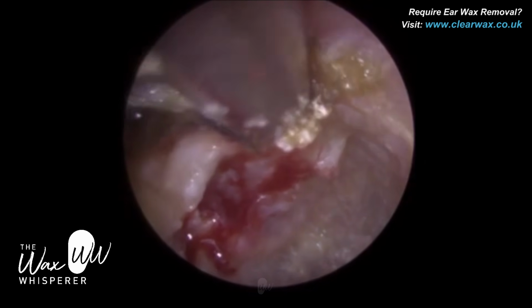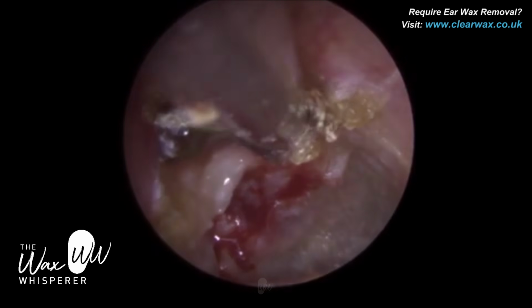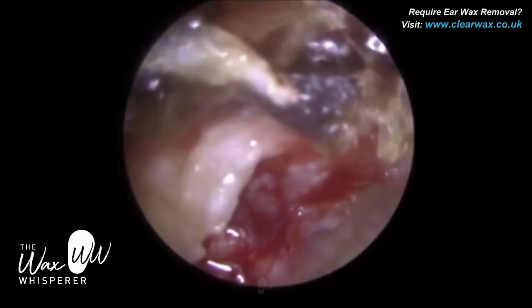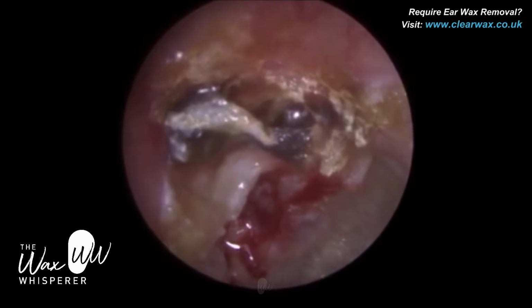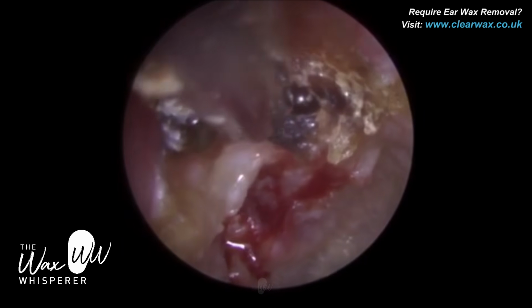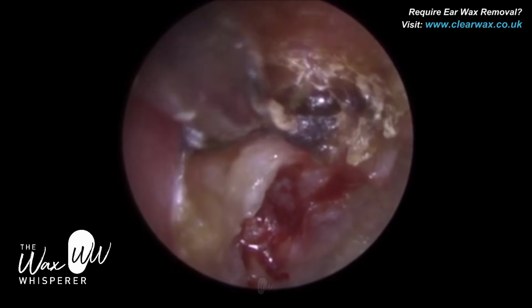So you can see I removed that outer plug of dead keratin, and now this is the cholesteatoma. It's the main part of the cholesteatoma that's stuck in the retraction pocket, and you can see the top part of the eardrum very, very red. It's inflamed. It's got vascularis there, and there's a severe retraction. And again, I'm being so delicate because if this is in the middle ear, I don't want to be removing this because you could cause kind of trauma to the patient.